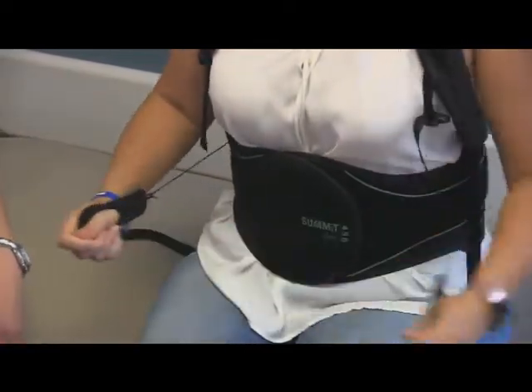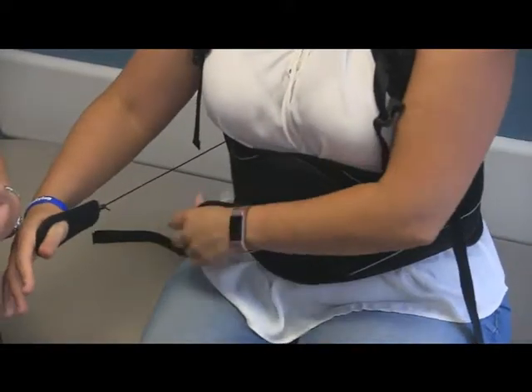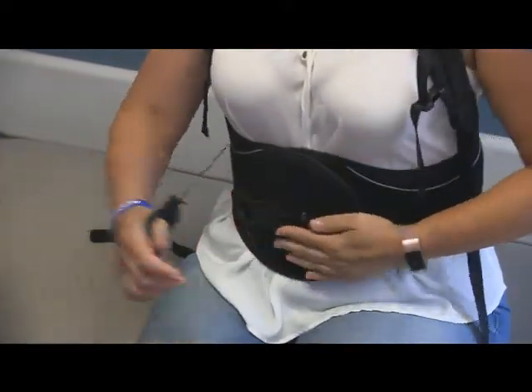You want this brace to be as tight as you can tolerate it while still being able to take a deep breath. So take a nice deep breath and then tighten them.